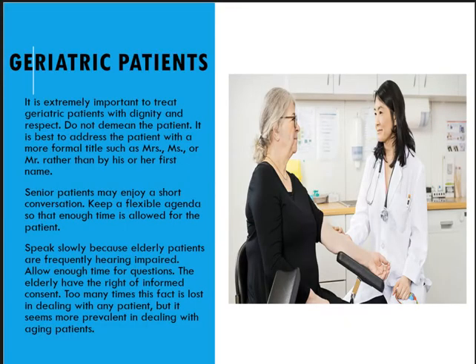We have geriatric patients. So one thing you have to take note, guys, for oldies, their veins, guys, are usually prominent, but take note, their veins tend to roll. Okay, they tend to roll from side to side. So what you have to do is, this is their skin, pull it like super hard. Like pull it backwards using your thumb. Hold it using your thumb, and then make your puncture. Okay, so that the skin will tighten in that area, and it will also tighten the area between the vein, so that dili siya mo roll. Okay.